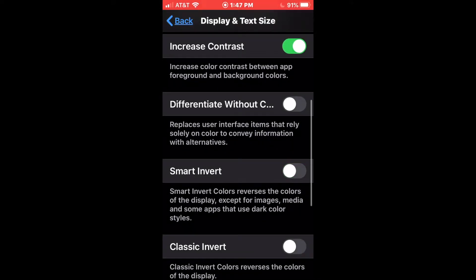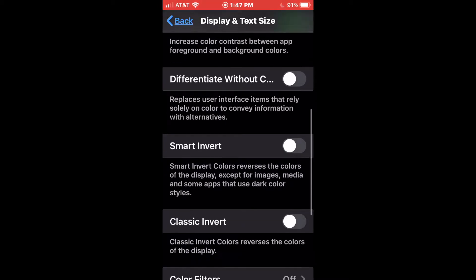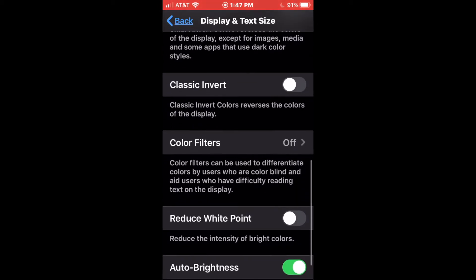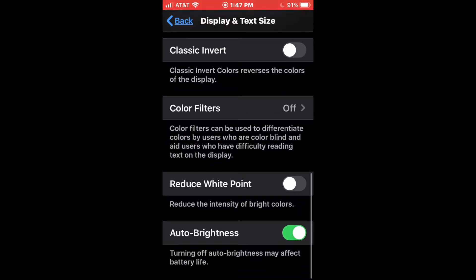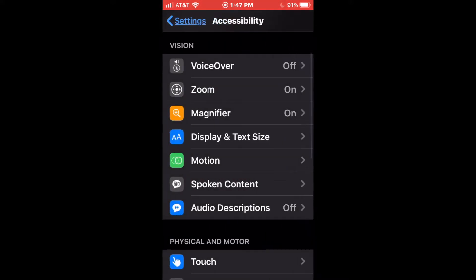Let's go ahead and turn that off again. We also have classic invert. That inverts everything, including the color of pictures and things like that, so that can make some things look kind of crazy. So smart invert is generally the best way to go with that. Anyway, that's display and text size — I just wanted to have a brief look at that. But we're mainly going to be looking at the zoom here.